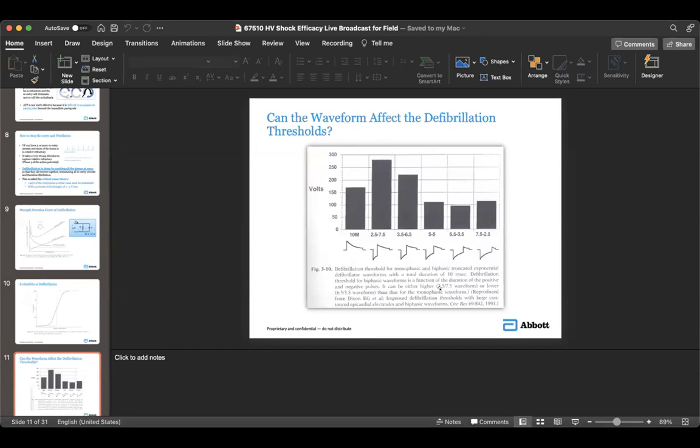So, Dr. Edafe, this means we should be counseling the policymakers and administrators. When they are purchasing those machines, they should contact the end users and the specialists, for example, to get the machine with biphasic, sync mode, and pacing modes. So this is the best defibrillator. It has the pacing mode, it is biphasic, and it synchronizes. But sometimes policymakers and administrators just go and get a contractor and bring monophasic, with no pacing mode in it. And you have to work with what you see in the hospital, and it doesn't all go well. So I think we have work to do to convince them. Always consult the specialist.